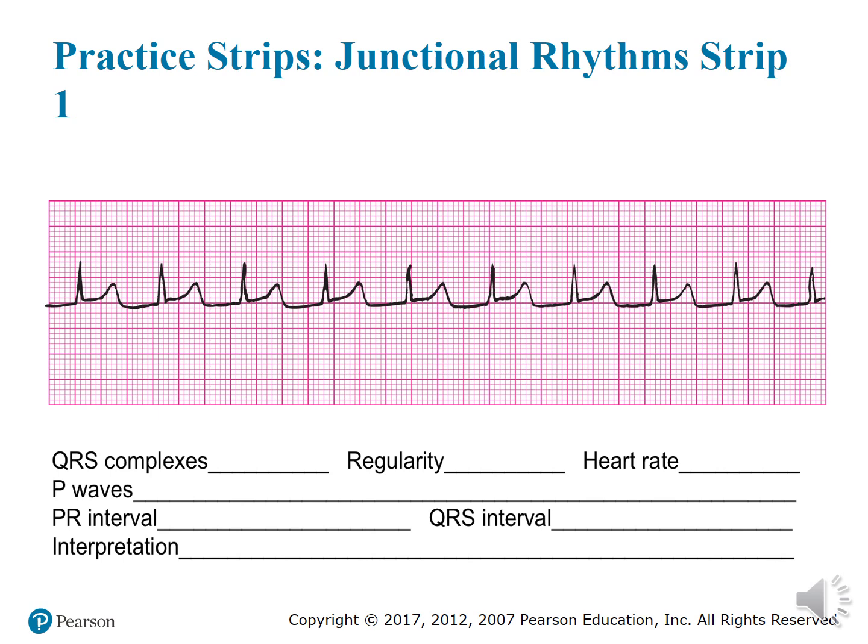Let's take a look. First of all, we have to always remember chapter 6. We always have to ask ourselves those 5 questions. Question number 1, are there any QRSs? Yes, there are. The next part, part A of question 1, is basically describing how the QRSs look.